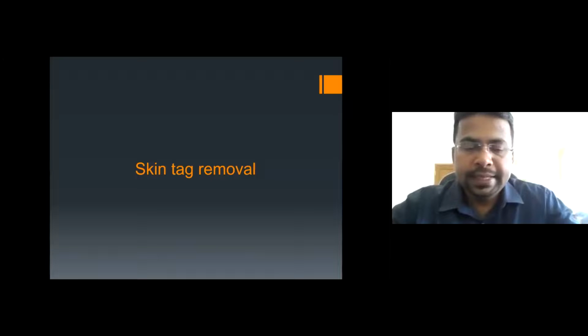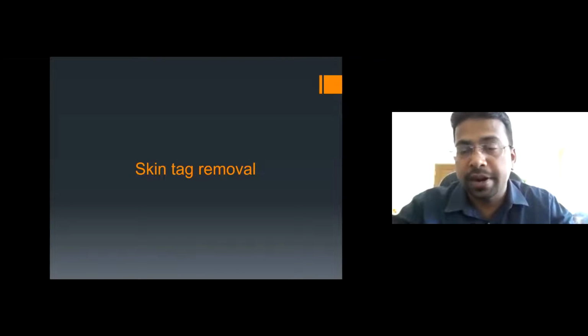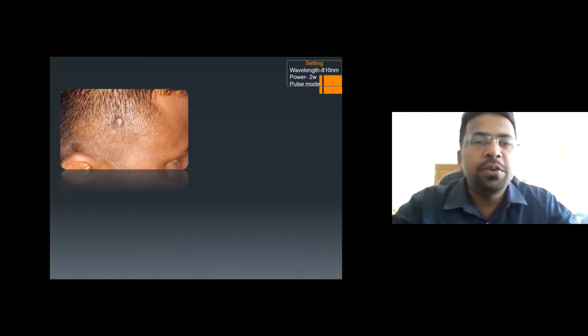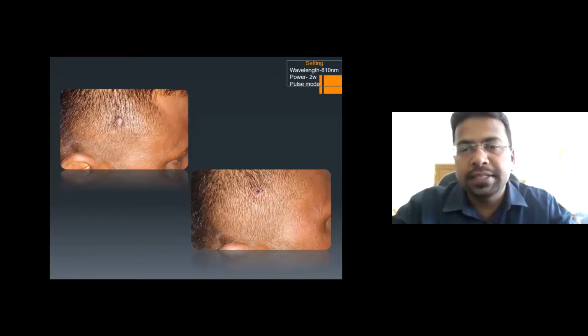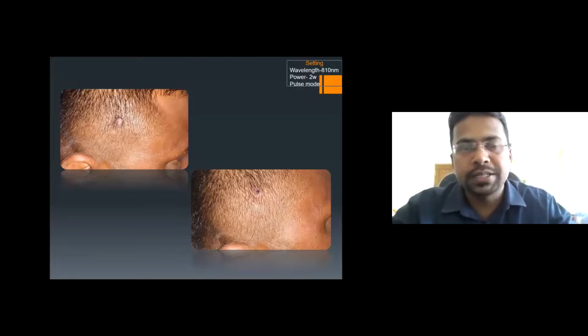Now let's see some more uses of lasers. We can use it for removal of skin tags, mole removal, and wart removal also. This is a pre-operative photograph where we can see a wart on the scalp, and this is an immediate post-operative photograph where we have removed the scalp wart within 2 minutes.